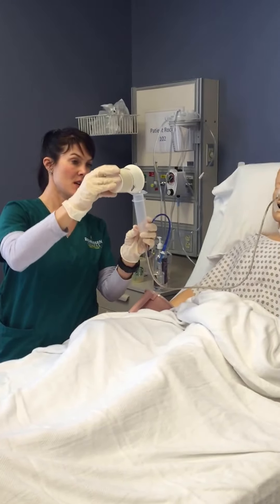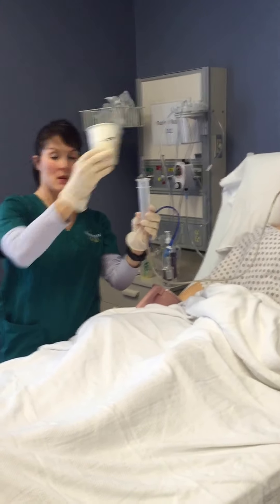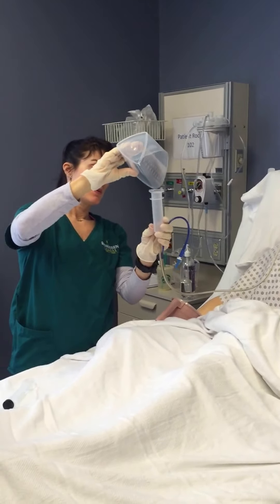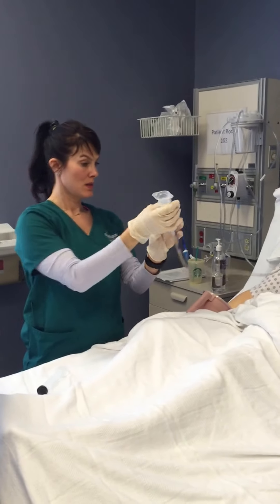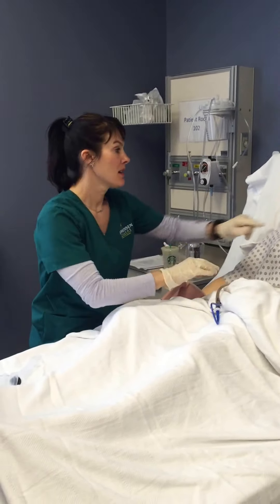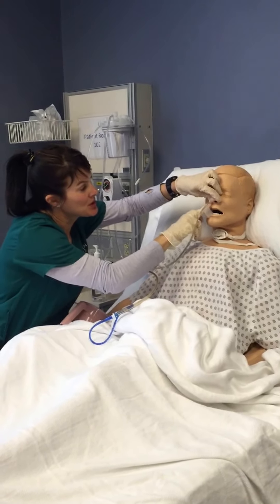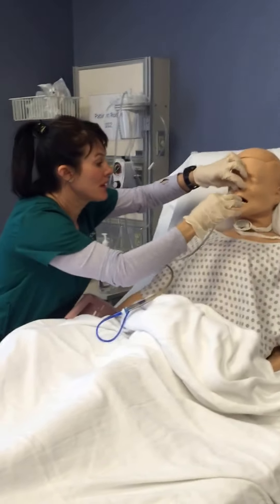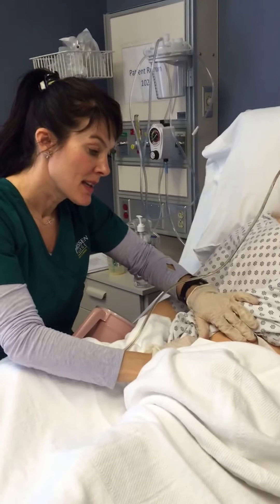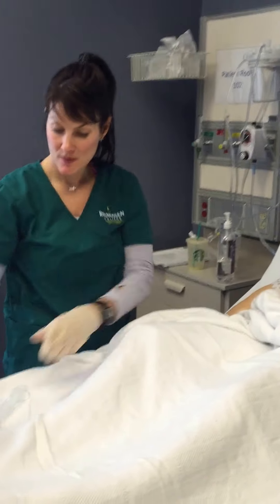I've got 250 mLs of nutrition here. I will adjust accordingly to make sure it flows appropriately. I'm going to do a little more water — another 60 mLs, or 100, whatever was ordered. Everything looks good. Now I'm going to secure my line, making sure I've got enough lubrication around the nose and no pressure ulcers. I'm also checking for the patient's comfort. If there were a G-tube in the tummy, I'd look for skin breakdown, redness, swelling, or any irritability.